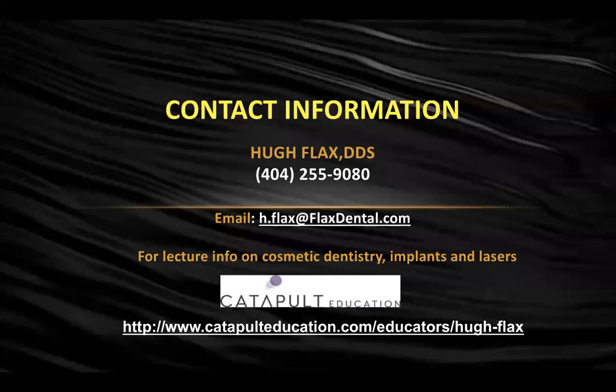And when I do that, and then with a very clean environment, you do use very good isolation on that. And then I go ahead and paint my bonding material, cure it, and then I go ahead and cement it. Knock on wood, I'm getting great results in terms of integrity around the tissues, integrity of the veneers, and them not coming off. And also, my patients aren't complaining about post-op sensitivity at all. So, of course, I expect them to stay away from acidic products and so forth. So that, I think, is extremely key as well.